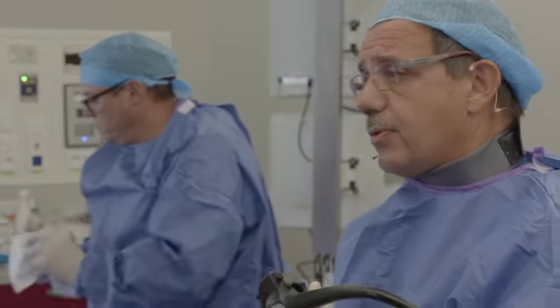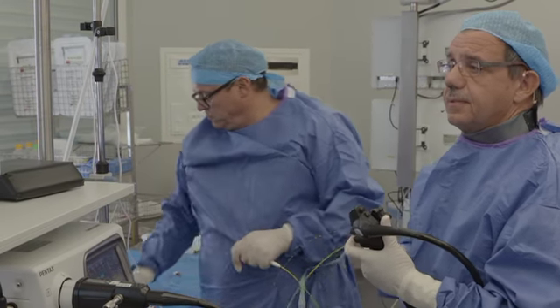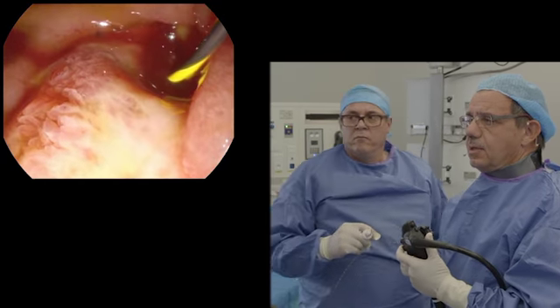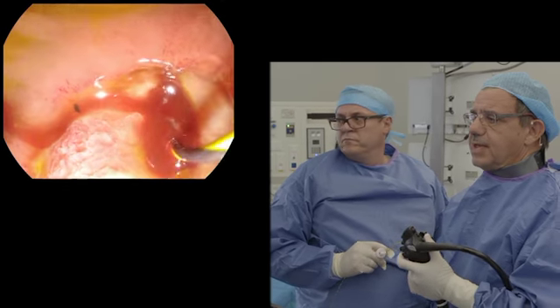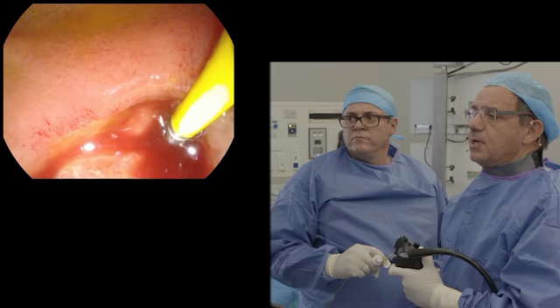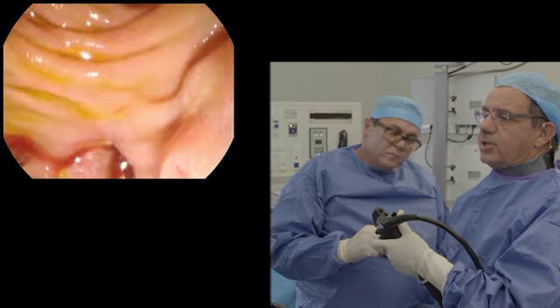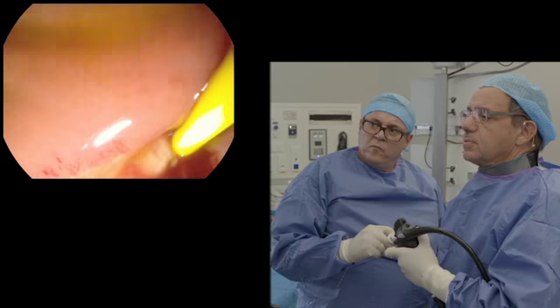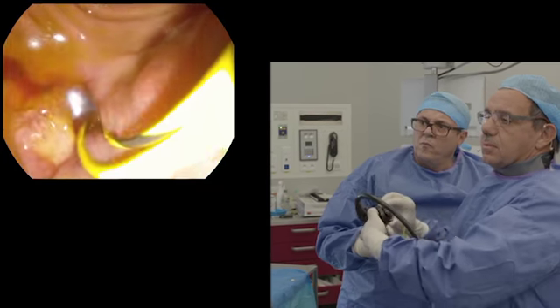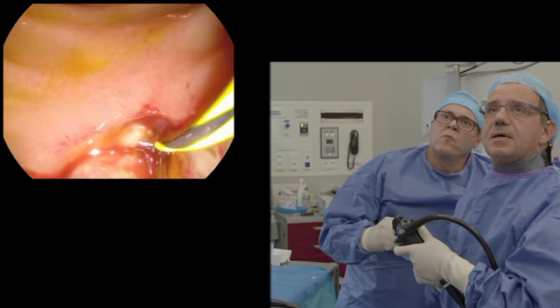Now the second part is to perform the biopsy. We use a biopsy forceps. Close. Okay. And I always leave the guide wire in place because it is the security. And now the technique for the biopsy is to put the tip of the forceps closed, of course, at the entrance, and with the elevator to try to enter here. I'm not in a good position. Yes. X-ray. Now the forceps is inside the bile duct.